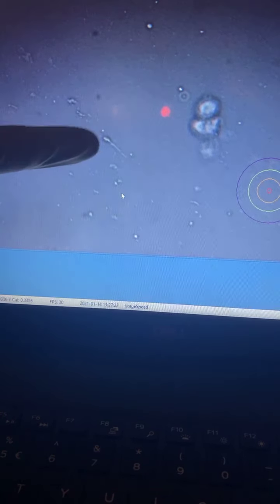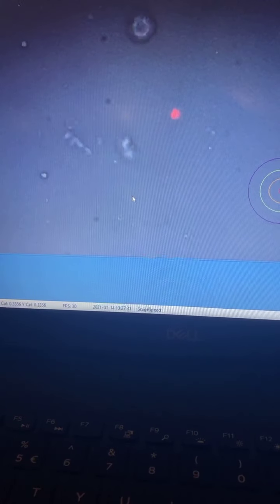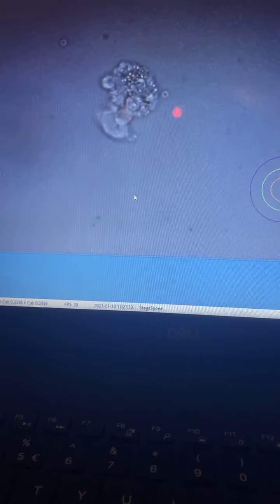This is a sperm but it is an unhealthy sperm — I'm not going to use this one. I'll culture this and I think I'll be able to get a good result. I'm trying to find something more accurate — a cluster of sperms if I can. I've finished visualizing around 20 fields; I need to visualize close to 100. Even if you find sperms, please visualize the 100 fields — keep this as a routine. See, one more great sperm right here in the center.